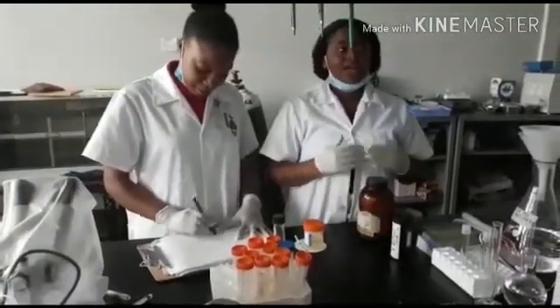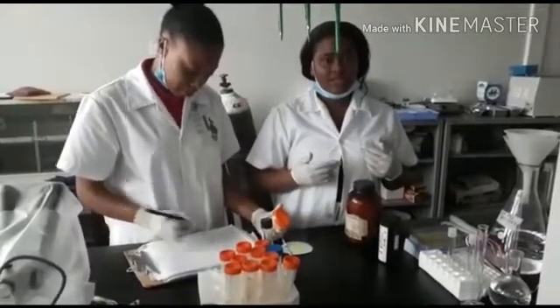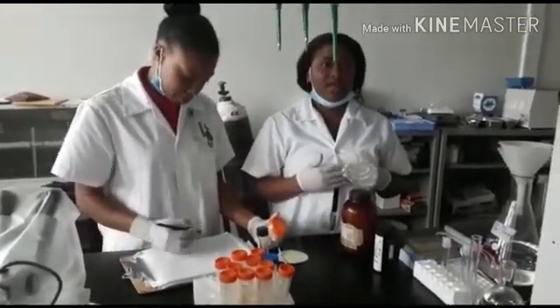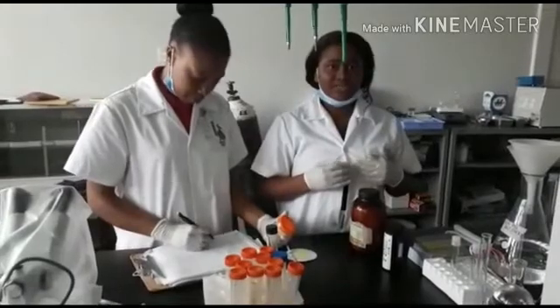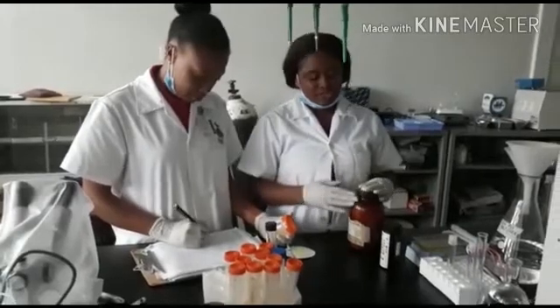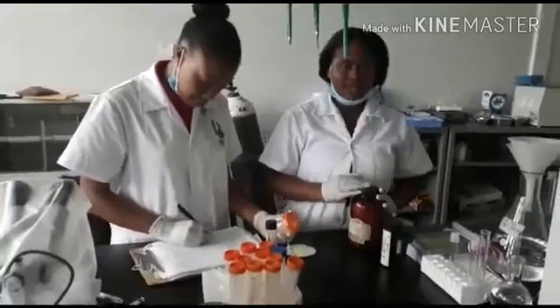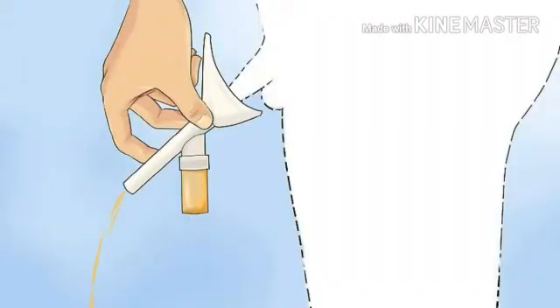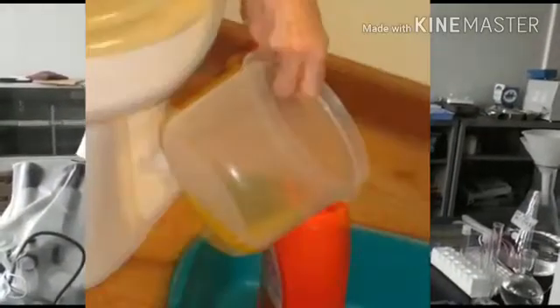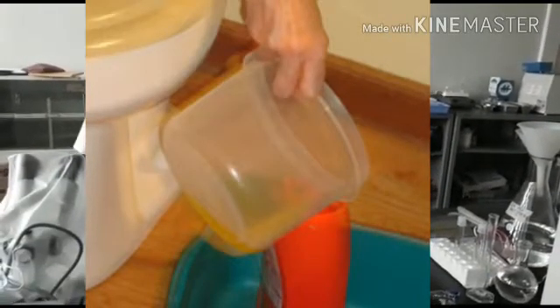For the 24-hour urine collection test, a nurse usually asks the patient if he or she is on any over-the-counter medication. If so, the patient has to stop taking these during the 24-hour period. The patient is usually advised not to change their diet and continue their daily food intake. The patient is given a specimen bottle to void urine in. Men can void their urine directly into the bottle. However, a female can urinate inside a cup and pour it into a specimen bottle.